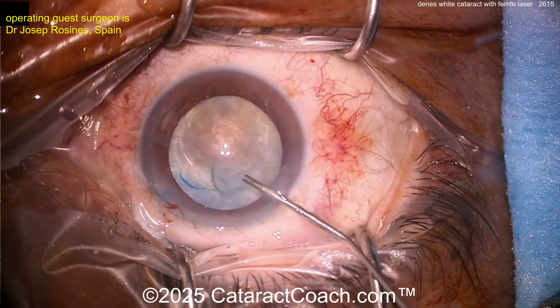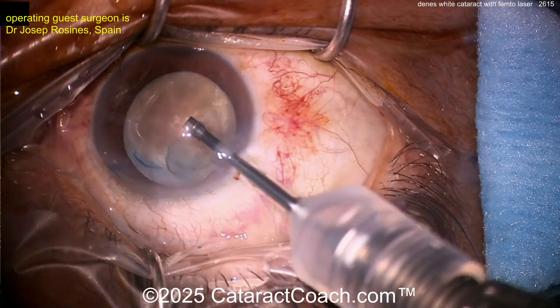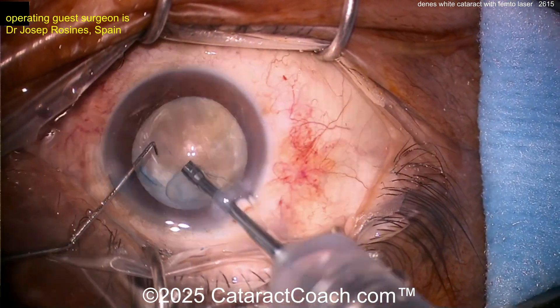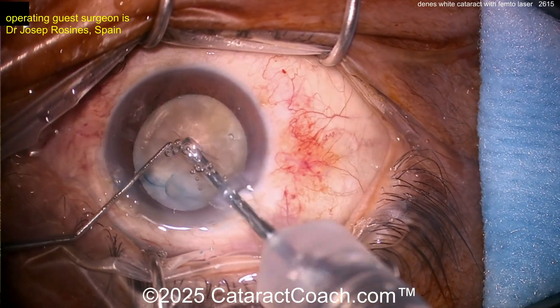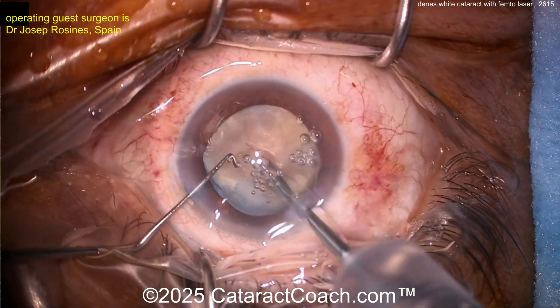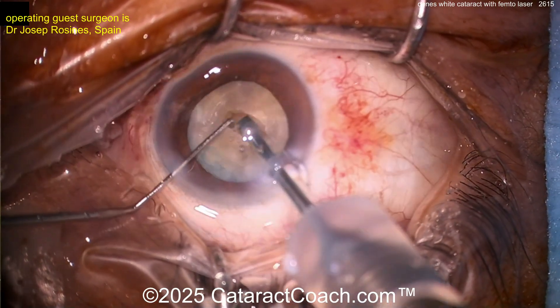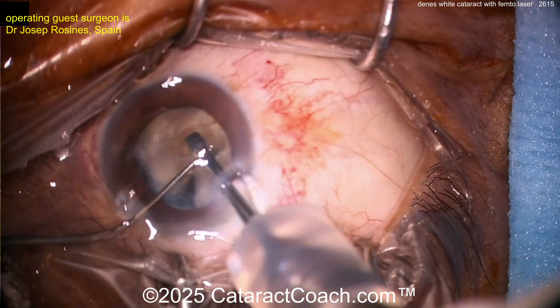Let's add a little more viscoelastic and go inside the eye. There's certainly some density to this nucleus. We've got a phaco probe in the right hand, chopper on the left. The technique here looks like a groove down the middle — perhaps a stop-and-chop technique. Nicely done. Let's fast forward a little — split that nucleus into halves.